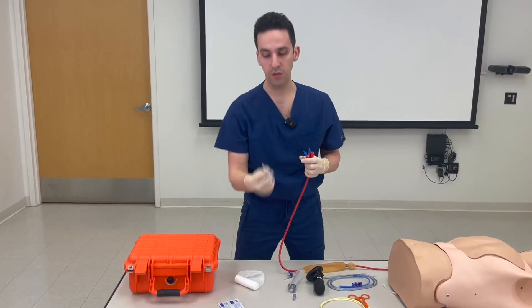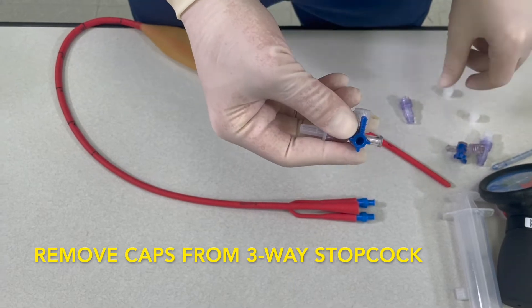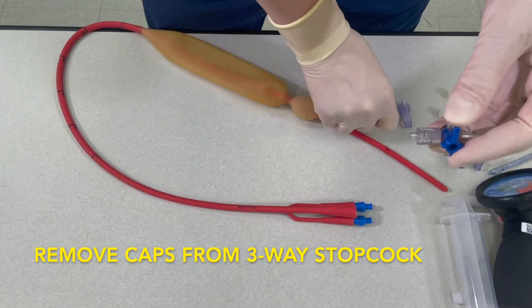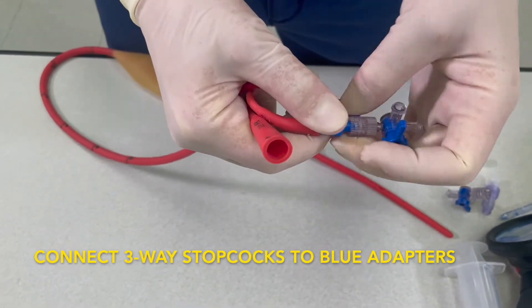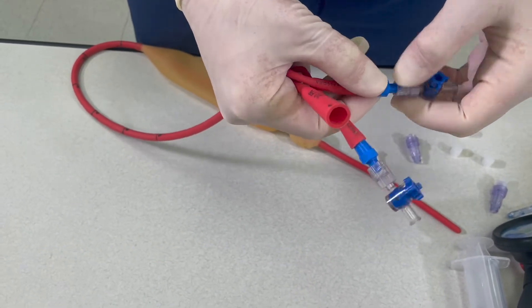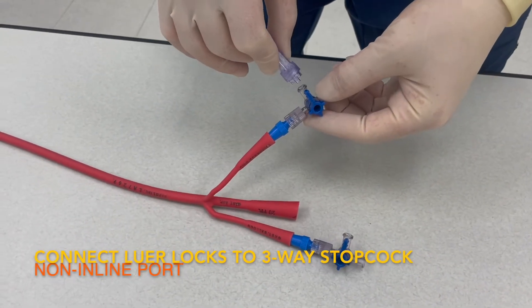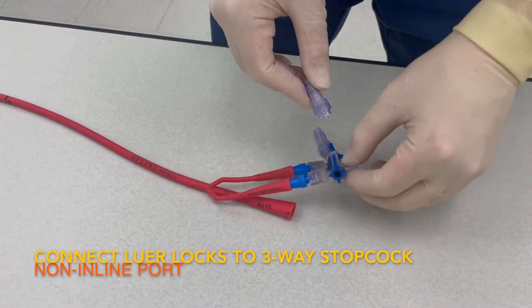Now take your three-way stopcock, remove the caps, and insert this into the blue Christmas tree adapter. You'll repeat this again for your other port. Take a Luer lock, remove the cap, and insert it into the non-inline port. Repeat this.